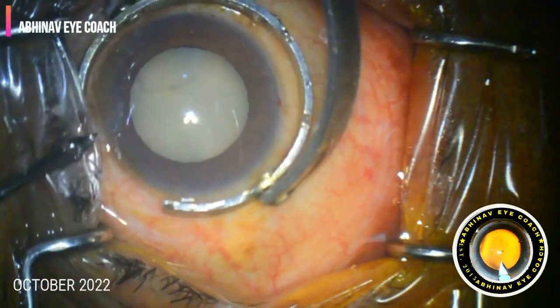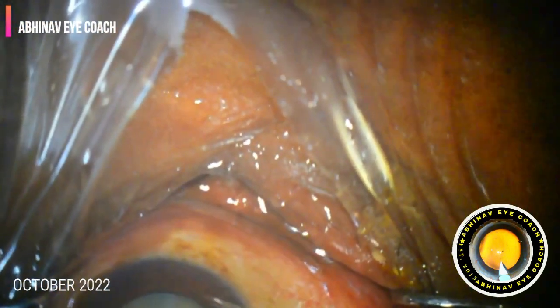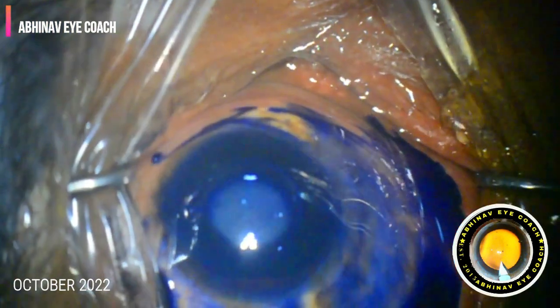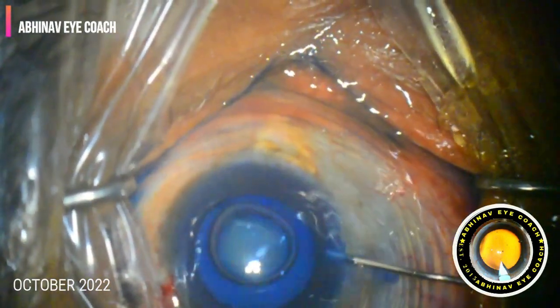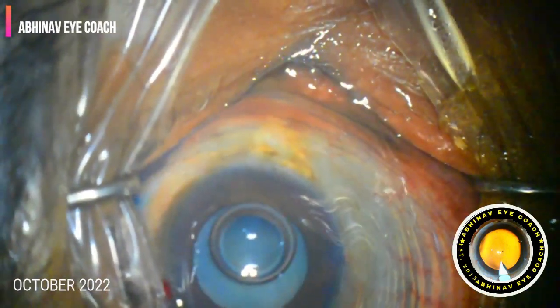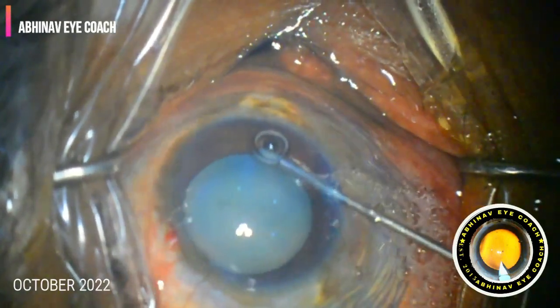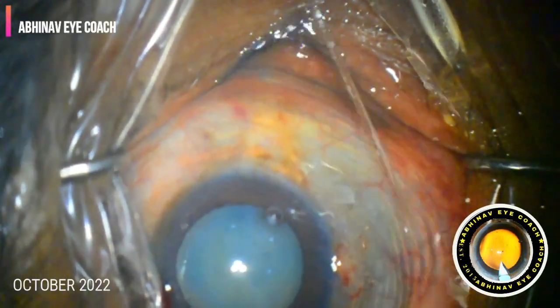As we can see, this is a mature cataract and seems to be soft, not very hard. We planned a routine phacoemulsification in this case and started by introducing local anesthesia — preservative-free lignocaine — into the eye.